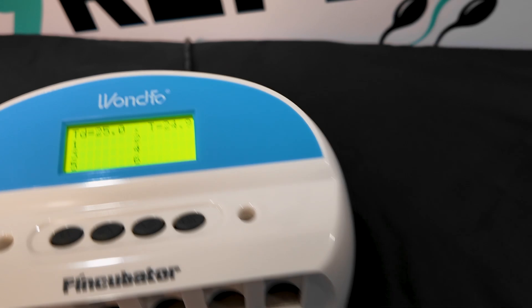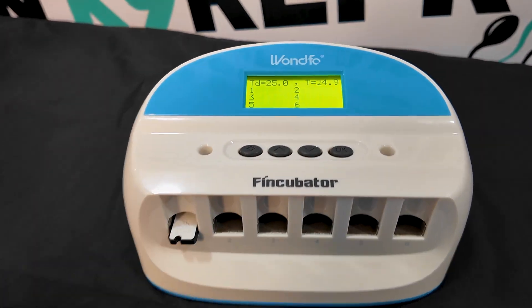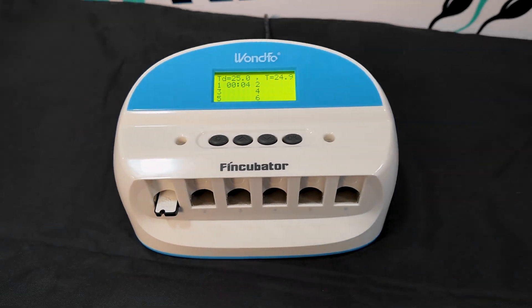During the incubation process, we'll use the FinCubator Temperature Control Chamber to maintain a consistent 78 degrees Fahrenheit. Any deviation from this temperature can lead to inaccurate results.